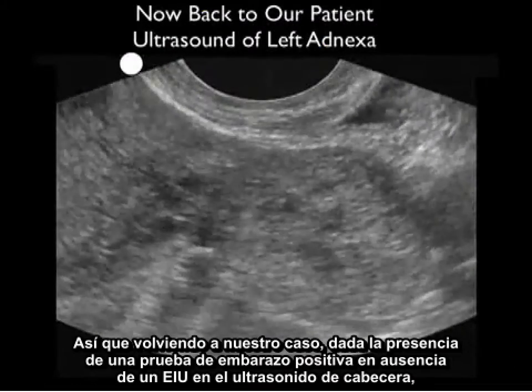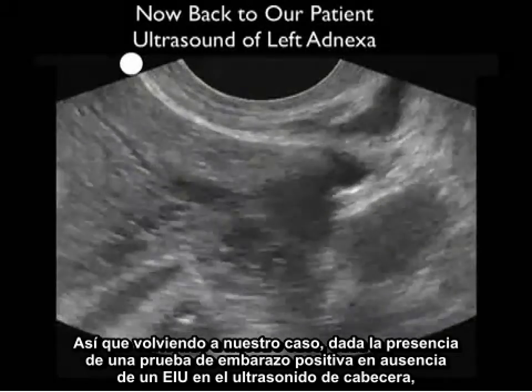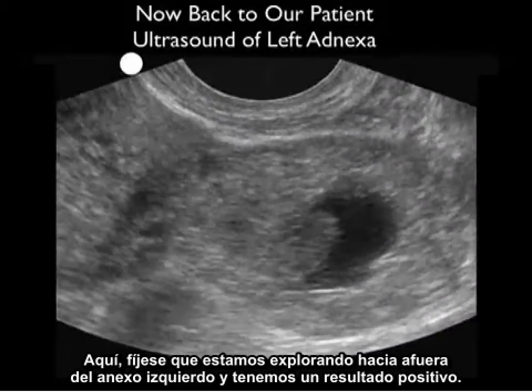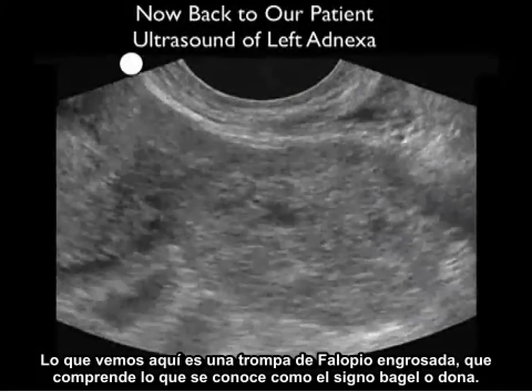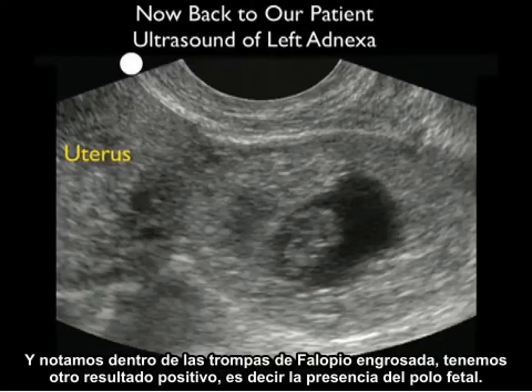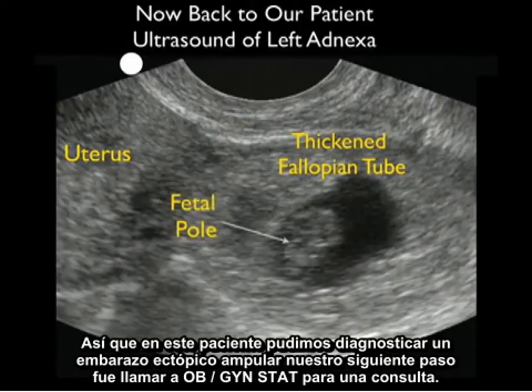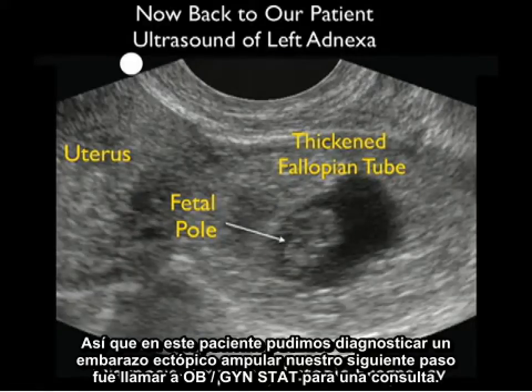Returning to our case, given the presence of a positive pregnancy test and the absence of an IUP on bedside ultrasound, we were very concerned about ectopic pregnancy and decided to scan out to the left adnexa. Here, notice we have a positive finding: a thickened fallopian tube comprising what is known as the bagel sign. And within the thickened fallopian tube, we have another positive finding — the presence of a fetal pole. In this patient, we were able to diagnose an ampullary ectopic pregnancy, and our next move was to call OB/GYN STAT for a consultation.